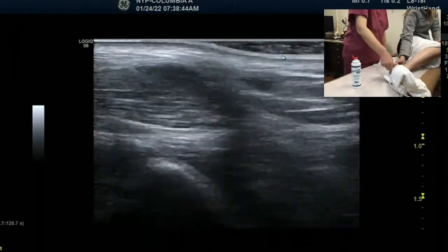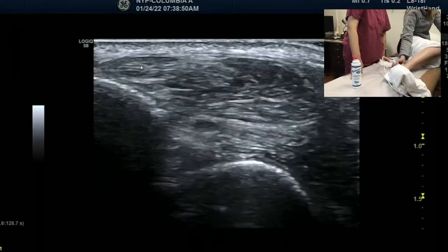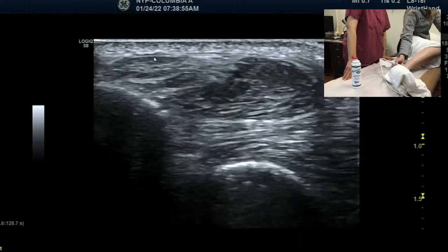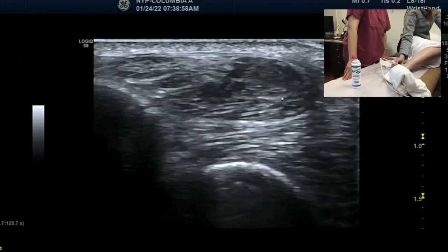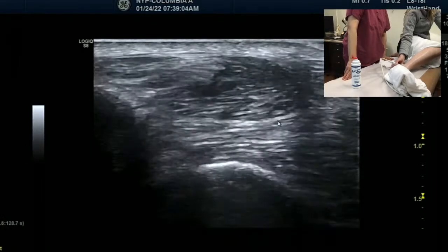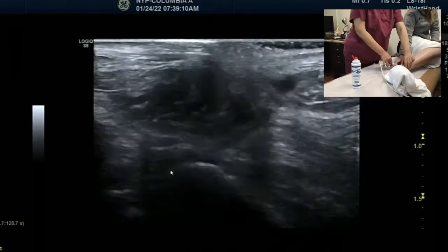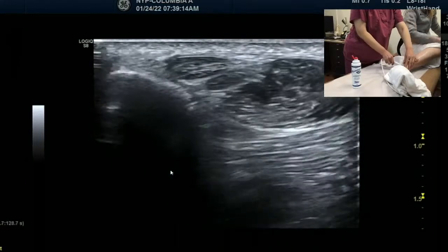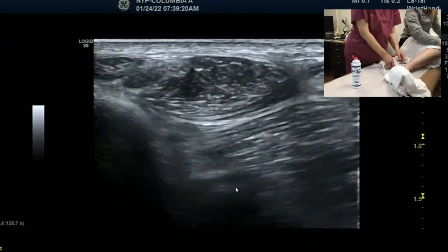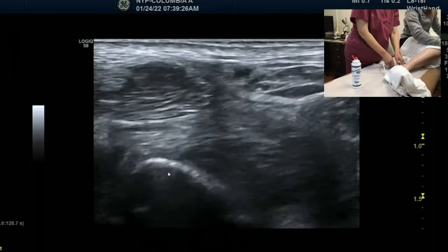Yeah, you have to go up a little, but there it is. Now you can see our tendon. Do you toggle a little bit? Yeah, that looks pretty good for the tendon. Fibularis longus tendon, and then there's still muscle for fibularis brevis, lateral malleolus. What's this? Oh, this must be underneath the other. This is the lateral malleolus. It's going continuously. Yeah, shadow of the tibia because it's the other side. So lateral malleolus is to the left of the screen, and then this bony shadow is actually already the tibia.